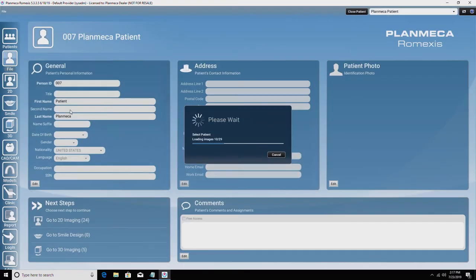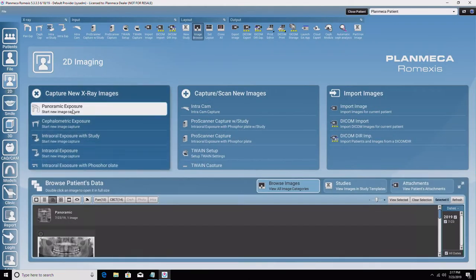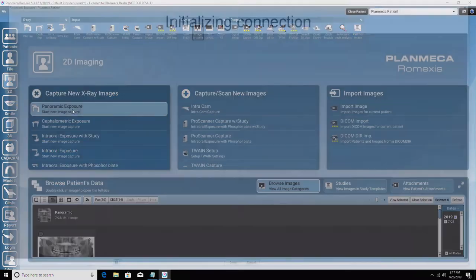Select the 2D module from the menu on the left, or choose 'Go to 2D Imaging' from Next Steps located on the bottom left of the patient dashboard. Select Panoramic Exposure from the 2D Imaging dashboard or from the top drop-down menu.